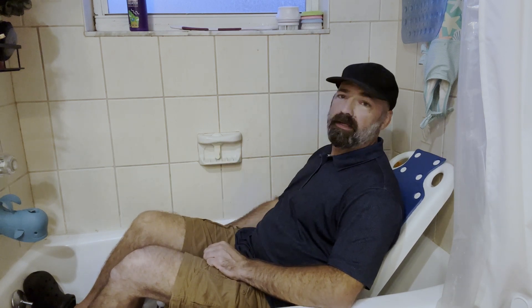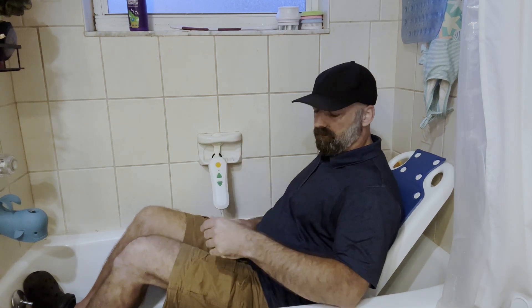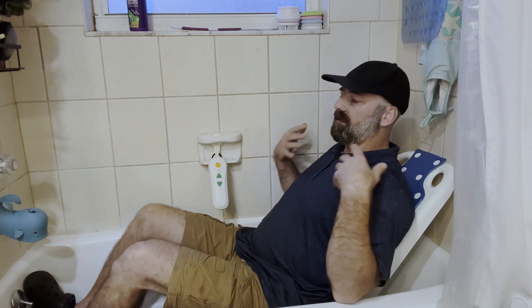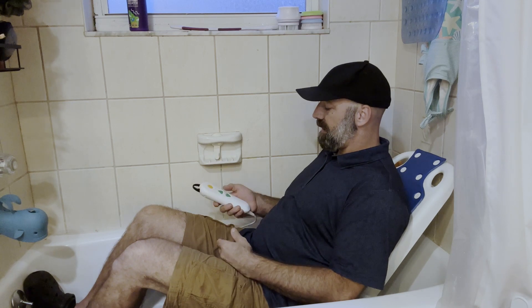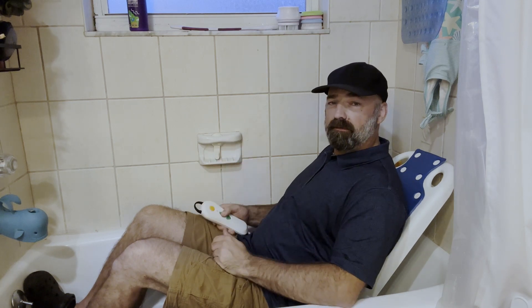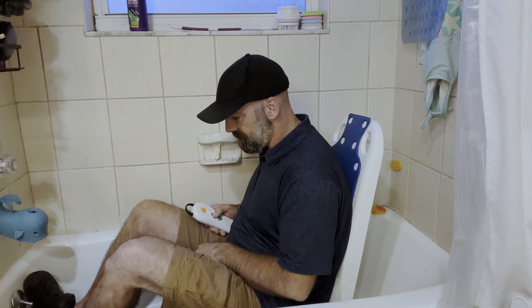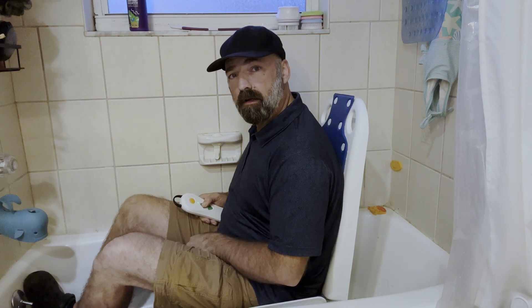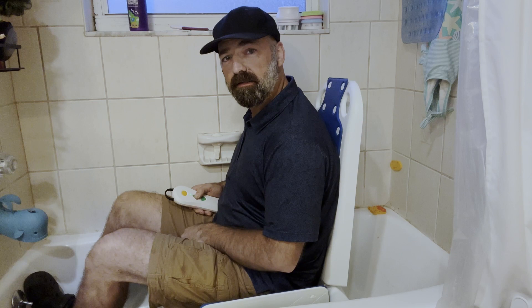I just wouldn't leave it soaking in the tub 24 hours a day, but the whole chair is waterproof. You can just sit here, bathe and wash yourself in a nice relaxed position. After your bath, when you're ready to get out, just hit the up arrow button — it's going to set you upright first, and then help you all the way back up to that sitting position where you can step out of the tub.